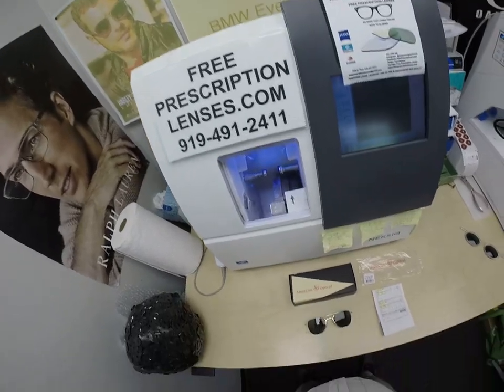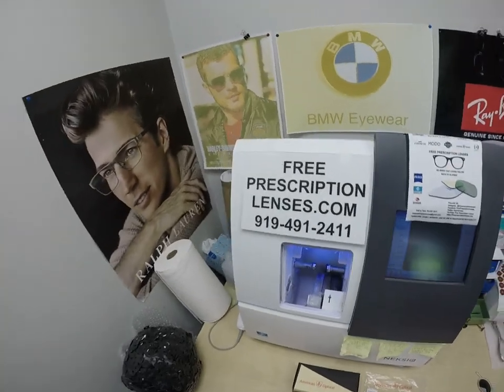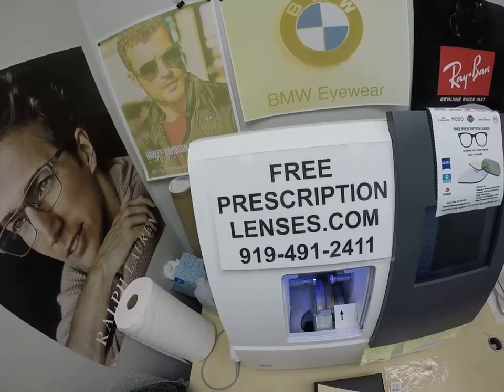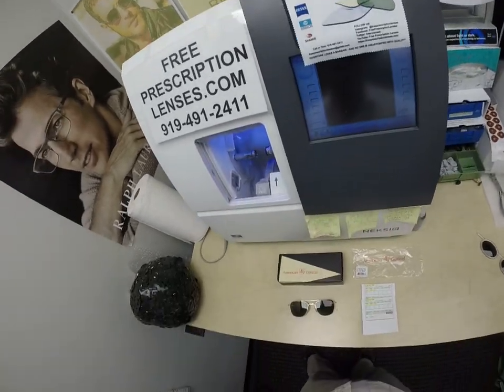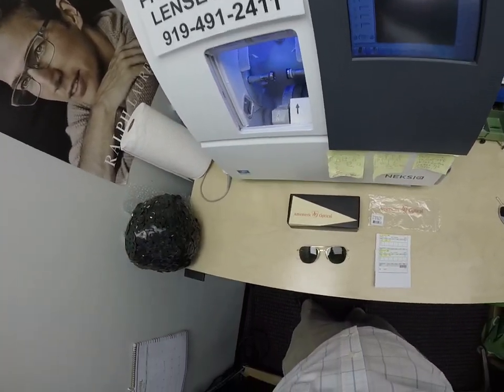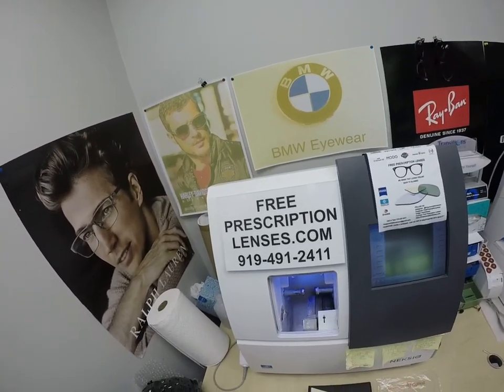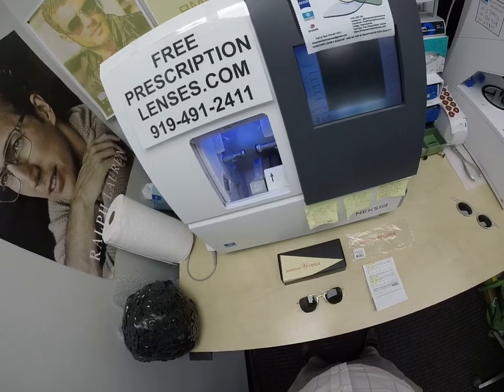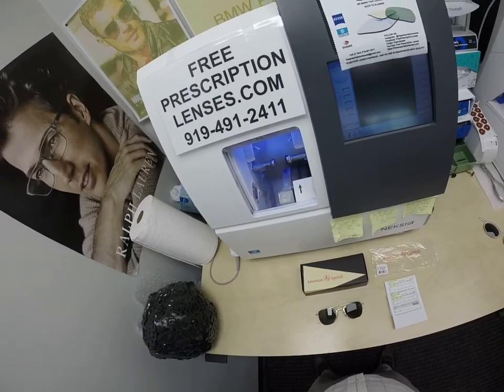Hello everyone. Special thank you to Marcus in Fort Belvoir, Virginia. This is freeprescriptionlenses.com, where everyone loves a bargain and no one is disappointed with quality. I am the hardest working optician in the industry. My name is C. Moore Better, but call me Mo — Mo Better — because I'm having C. Moore Better looking Mo Better and show everyone else how I bring that loving feeling back to glasses.